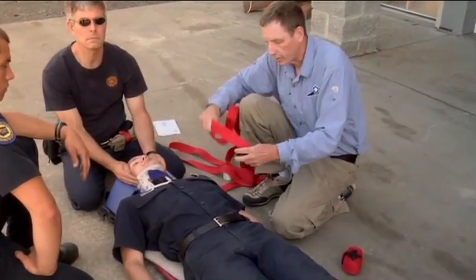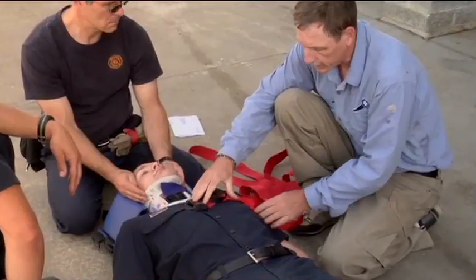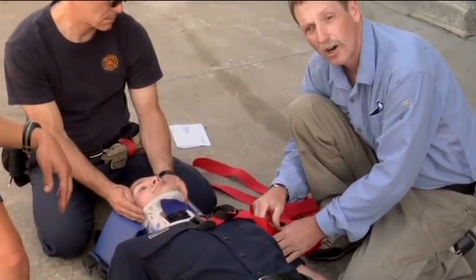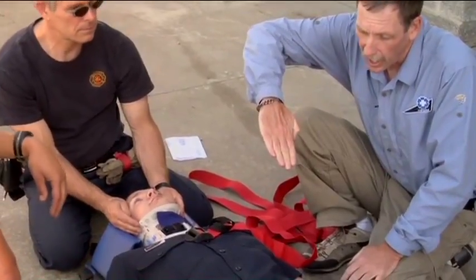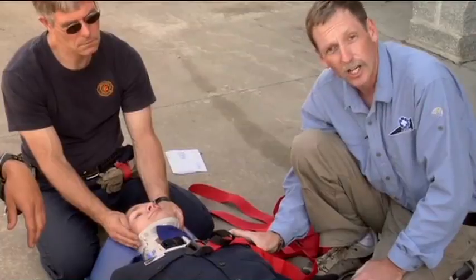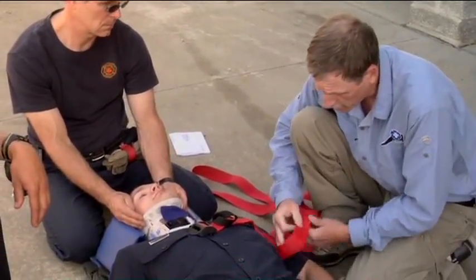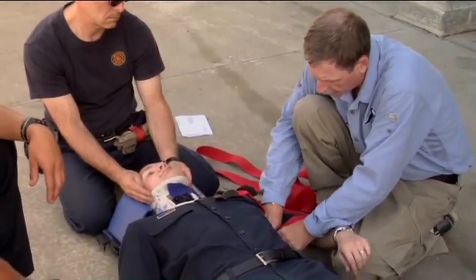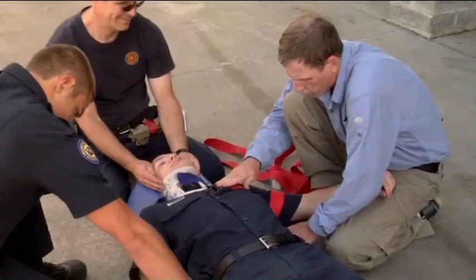And I'm going to start with this strap just above CPR position. I'm going to want these lateral straps to be high under the armpit, because if we happen to put the patient in an incline, head up incline, we want these straps to catch under the armpit to keep the patient from sliding down the board. So I'm going to start that way, and I'm just going to find a convenient hole, and I'm going to slide the strap through it.